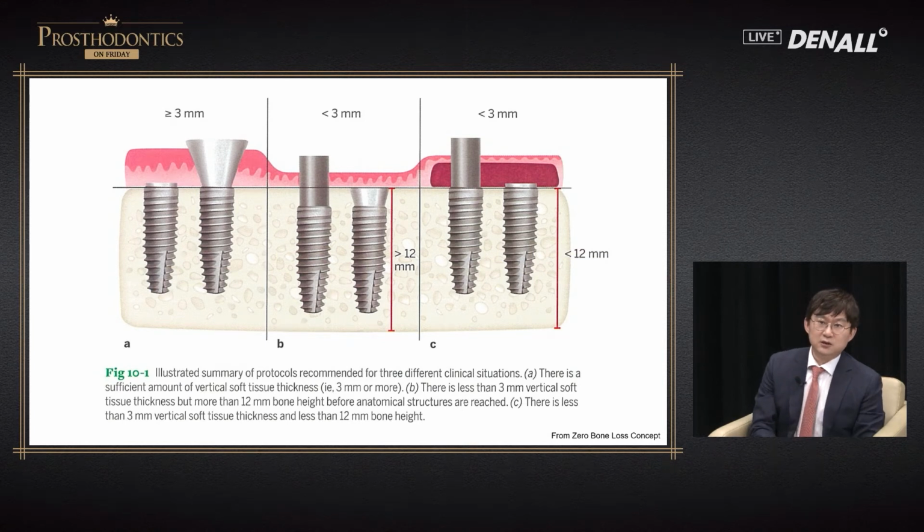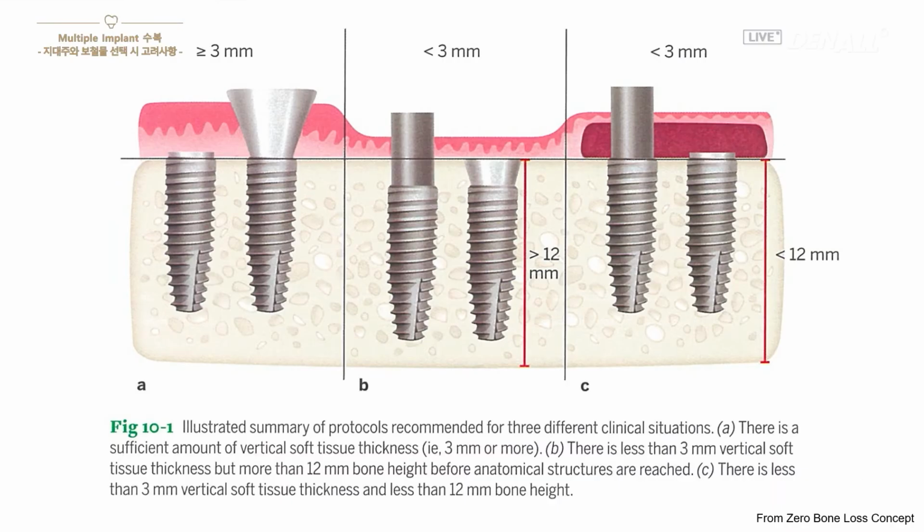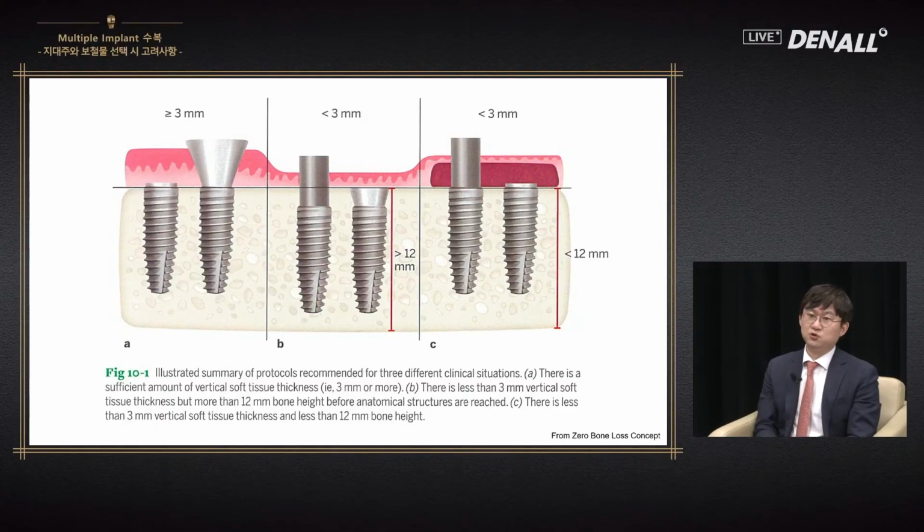To place an implant appropriately in terms of depth, biologically, with a platform switching implant, the TS type implant, if it is placed at the bone level when the gingiva is thin, bone resorption can occur. Therefore, it should be placed below the bone so that bone is not resorbed due to biologic width. That is recommended. This is the two-dimensional section.